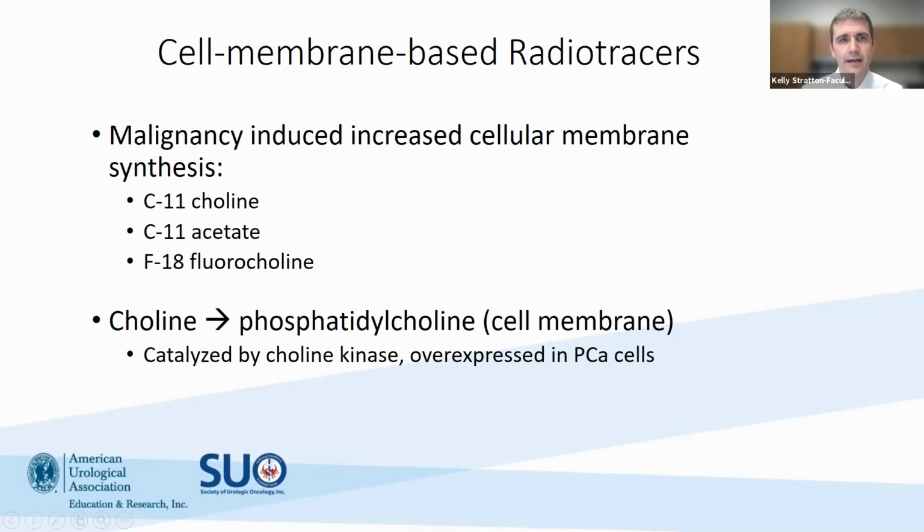Now, cell membrane radiotracers like choline and acetate have also been used for PET imaging targets. And so cancer cells have increased cellular membrane synthesis. That causes the radiotracer to be incorporated. Choline is probably the most common of these, but again, it has a very short half-life.